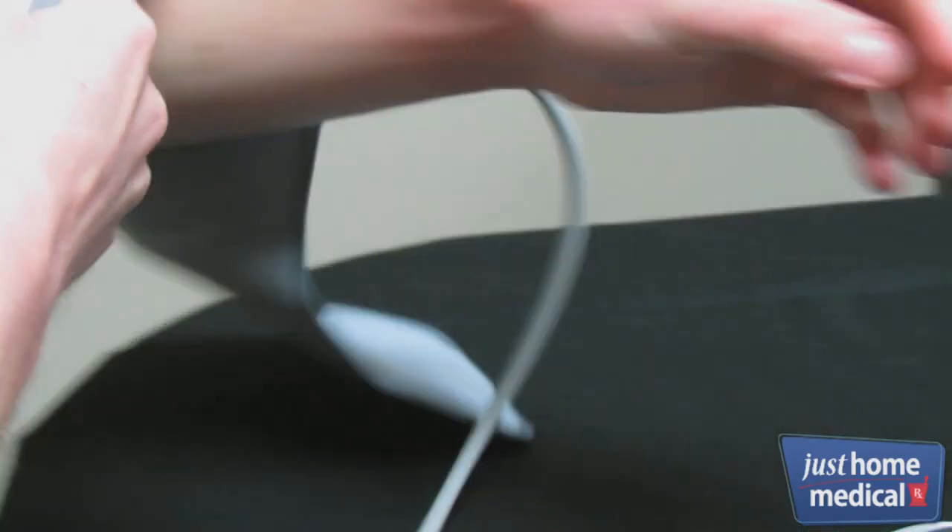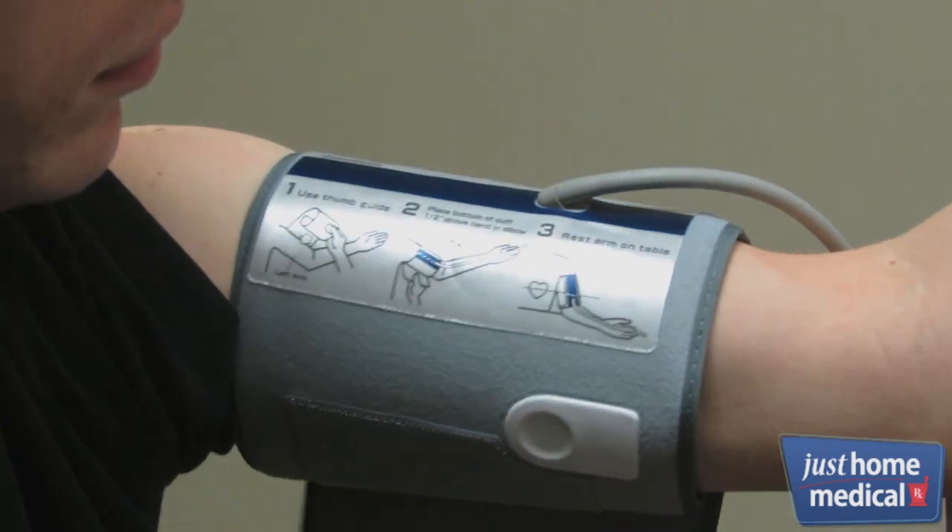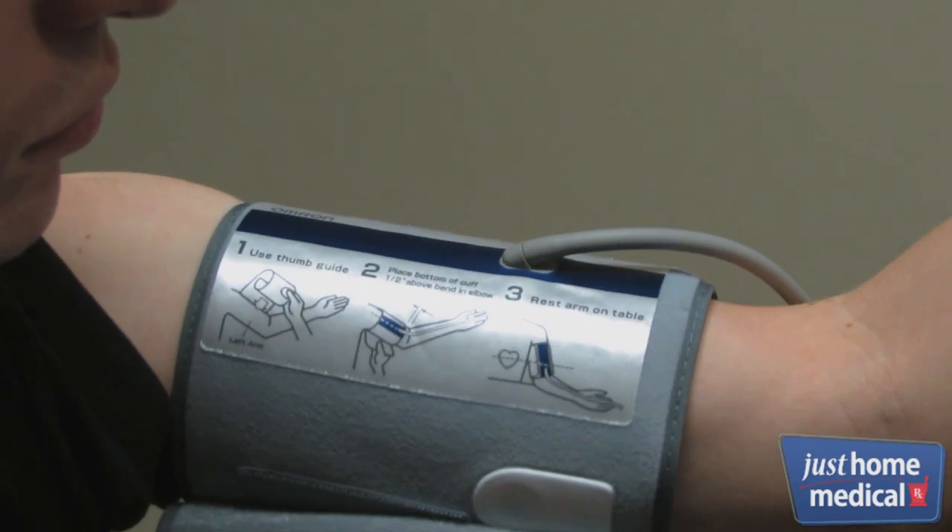Wrap the cuff correctly on bare skin around your upper left arm, leaving a half inch space between the edge of the cuff and your elbow. Align the cuff so the blue strip is centered on the inside of your arm with the tubing pointing down toward your hand. Close the cuff snugly.